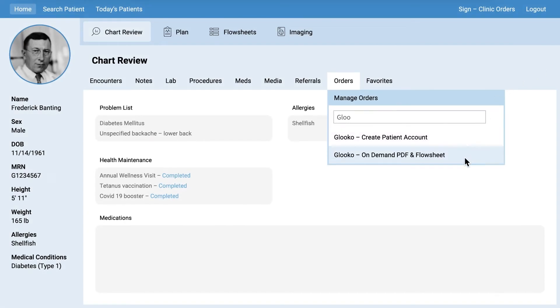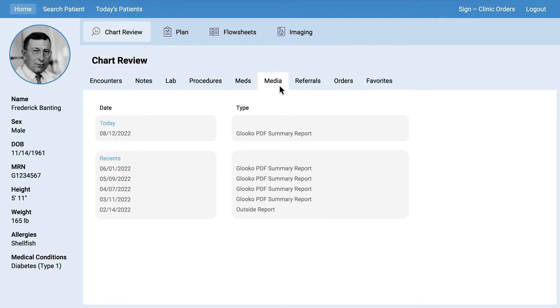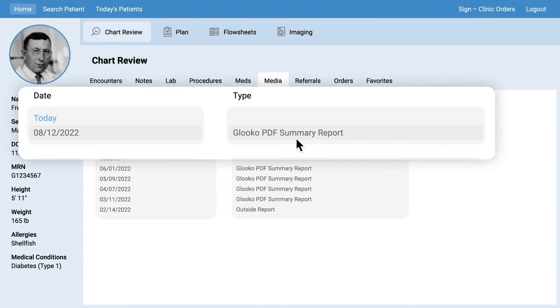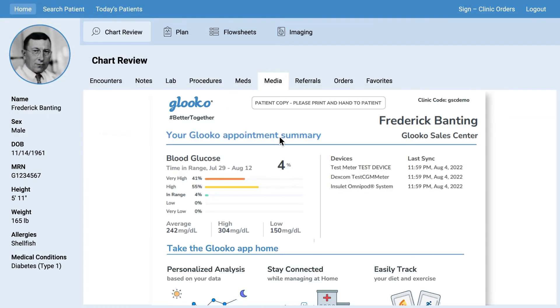With EHR integration, once the PDF report is compiled, Glooko automatically sends the report to the EHR. All of Glooko's PDF reports can be easily accessed through the EHR, including the historical archives of past PDF reports. With this integration, the user could do all their work, including reviewing the Glooko data and charts, without ever leaving the EHR.